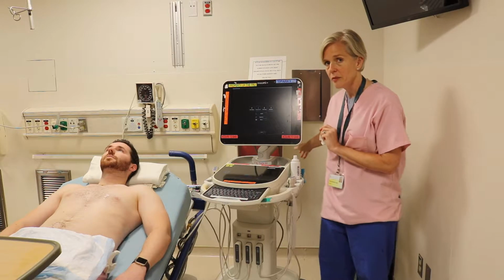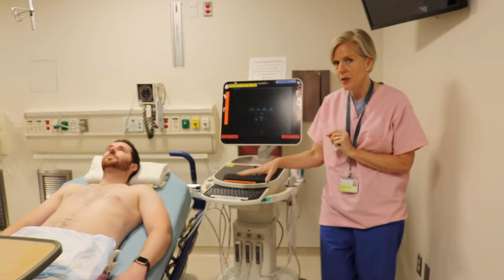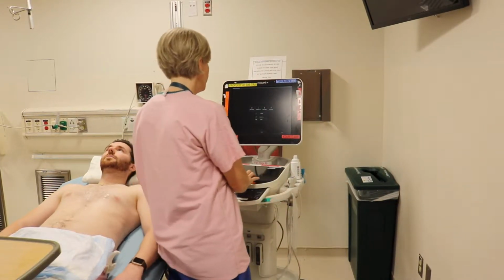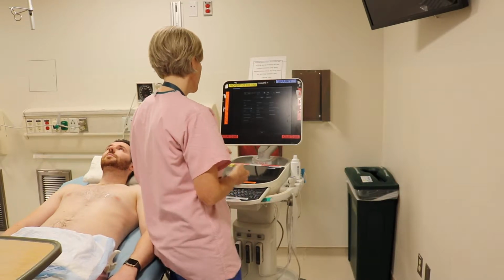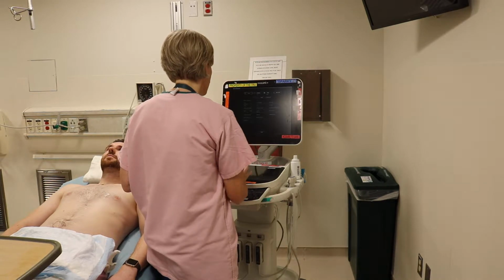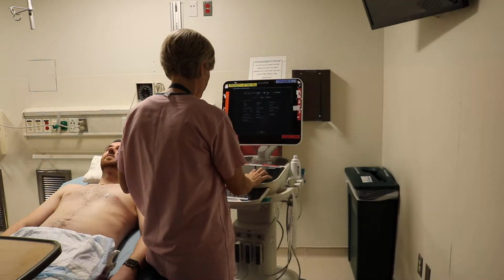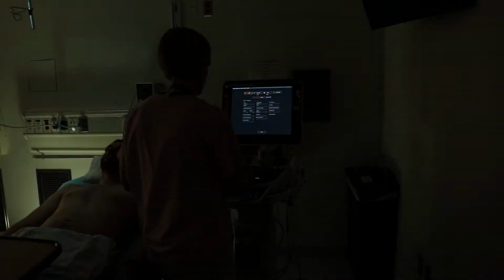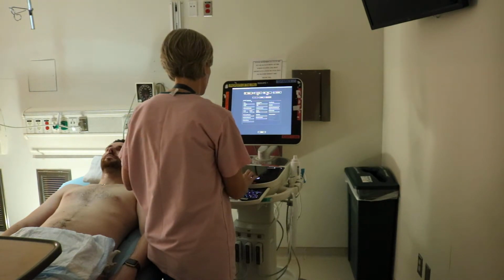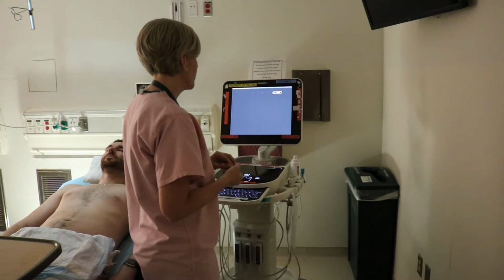After you've plugged in the machine, which you're going to do every time you use the machine, you're going to wipe down the probes, then you're going to enter in the patient data so that you can save your exam. For this Sparq system, you hit new patient, enter in the medical record number, and then at least the last name of the patient. And then save and exit. Now we're ready to start recording.